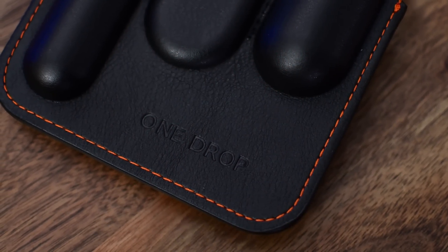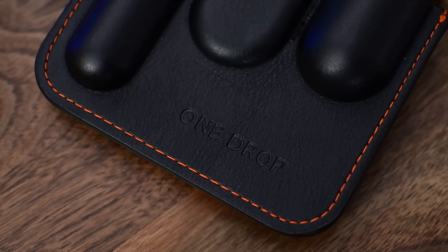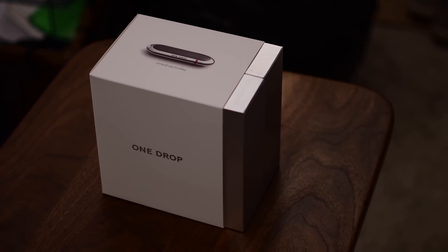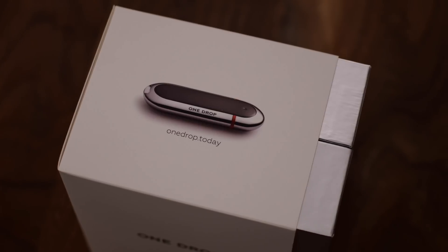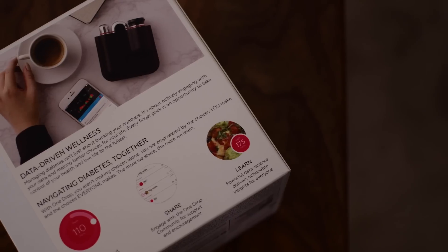Hello everyone. It is Andrew here from MAO Magic with the One Drop Glucose Meter. I love glucose meters — there are so many different ones out there on the market. And when it's something that you kind of have to live with every day, being a diabetic, it's definitely something you should put some thought into. This one is a little bit unique and very interesting.